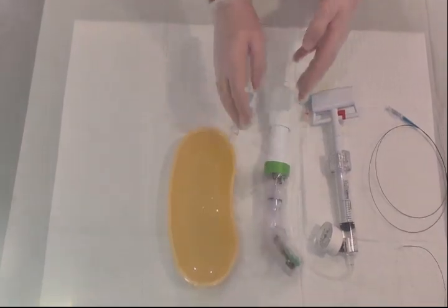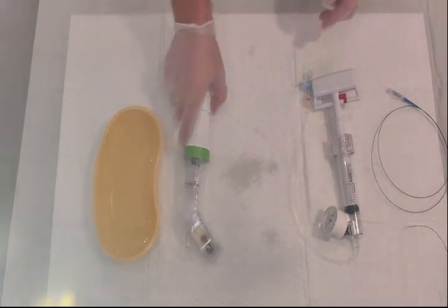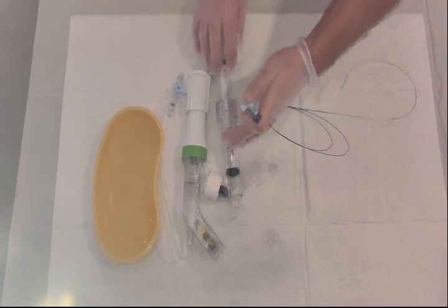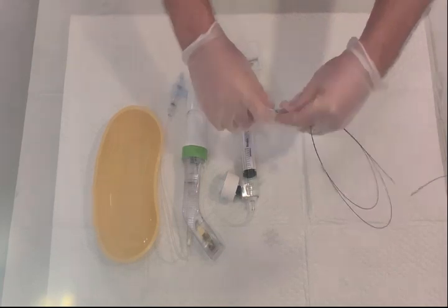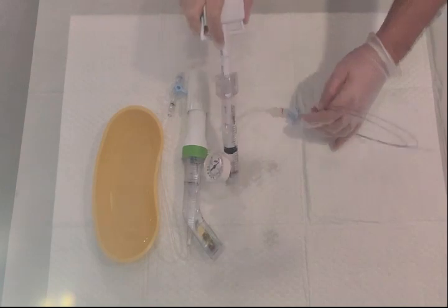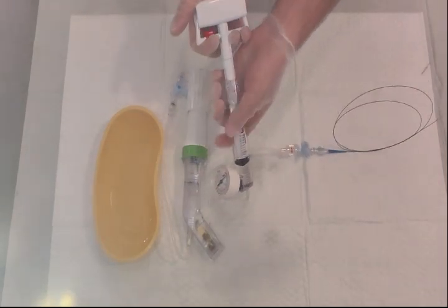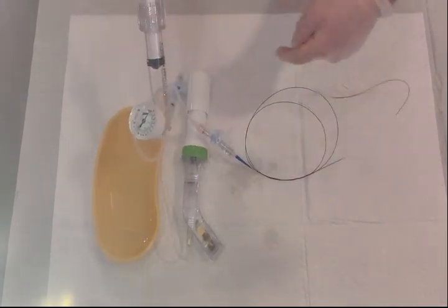Once the inflation device is ready, let's see how to use it. The stopcock opening should face towards the balloon. Some people make it fluid-to-fluid first; others connect directly to the balloon. The three-way stopcock should be open towards both the inflation device and the balloon. Then press the lock, retract the piston, and it will draw all potential air from inside the line as well as the balloon.